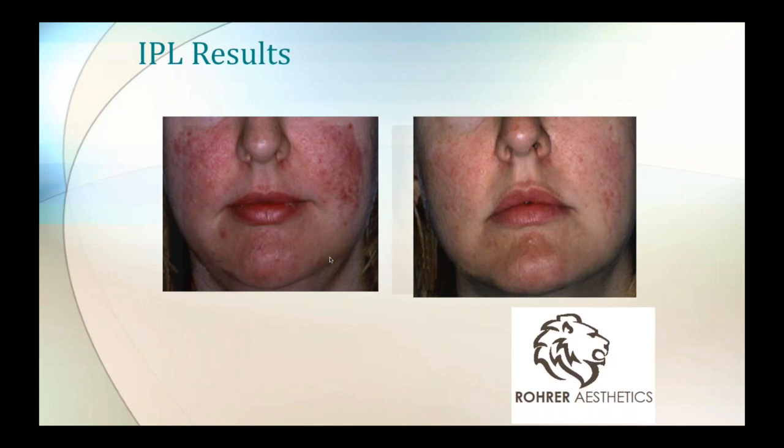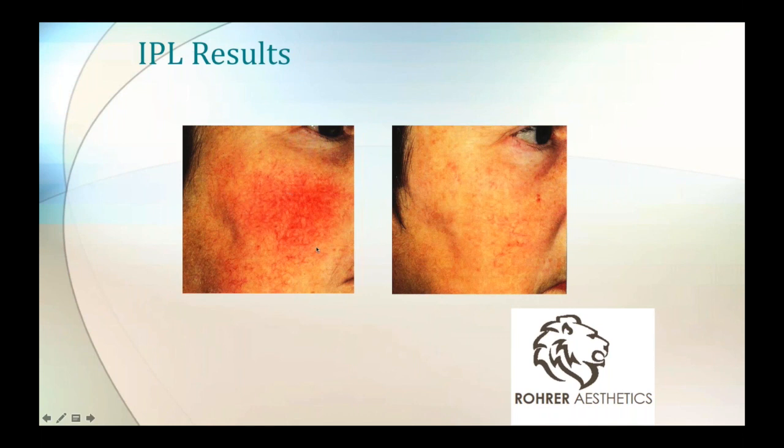And it's one of the well-known treatments for rosacea as well as acne itself. And you can also use it for vessel disorders like poikiloderma and things like that. This is another patient, with telangiectasias. This is a reasonable treatment using the IPL. I'll show one of my own patients with this. What I'll do is use IPL on this, and also during the same treatment, I'll use a long pulse YAG for some of the bigger vessels here.